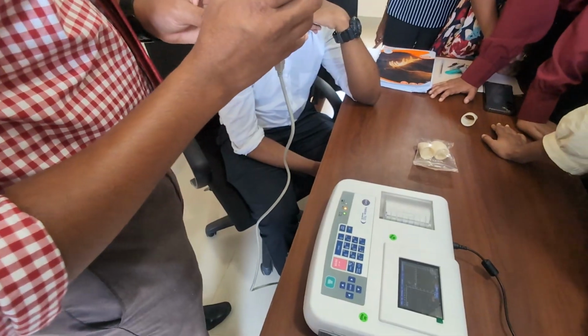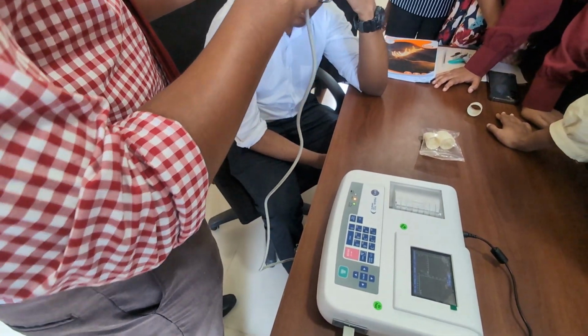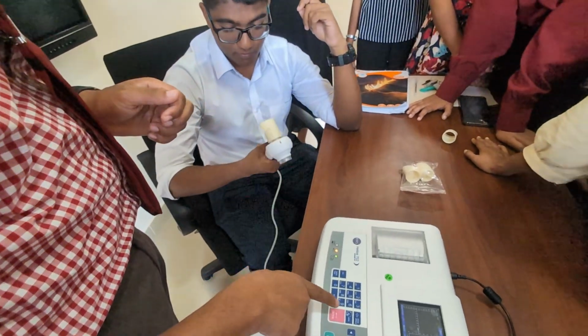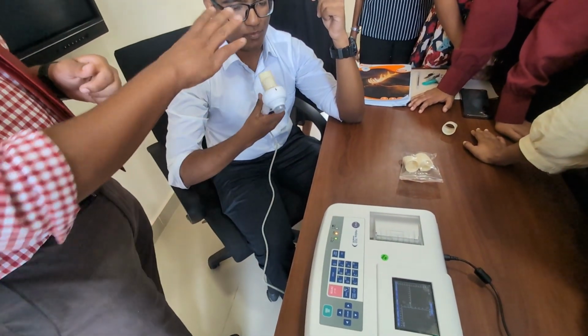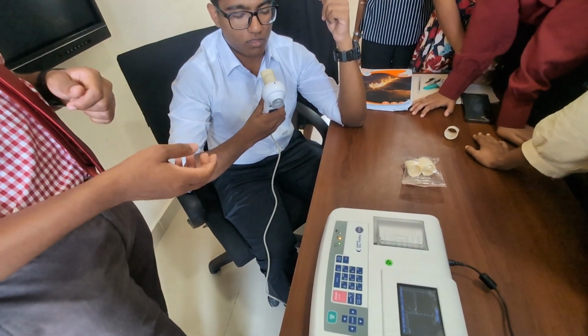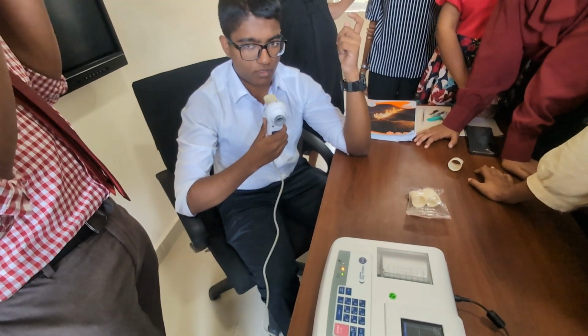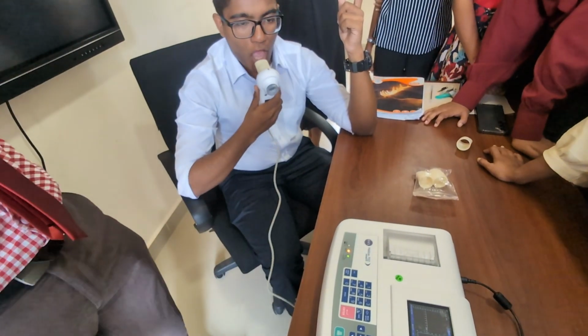So once we've given the patient the instructions, we give this to the patient, and we hit enter, and you can start. First normal 3 to 4 breaths, then take in a breath and exhale as fast as possible, then inhale again.